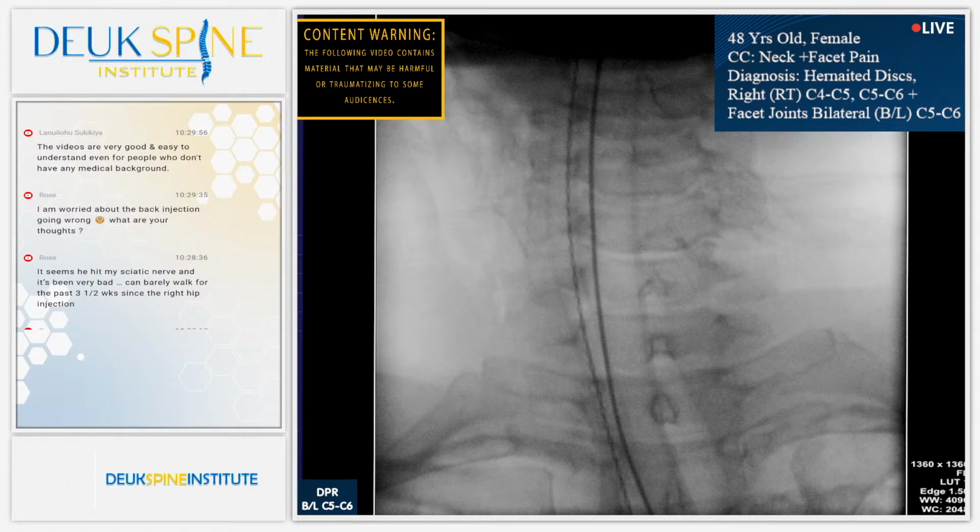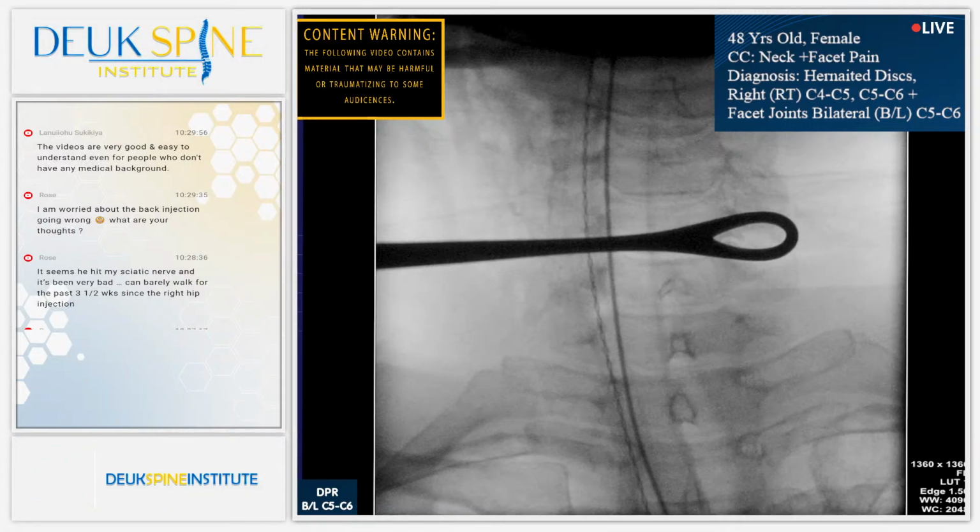I just want to show you guys the arthritis. Jordan, show them how much arthritis there is in these facet joints. That was the left side, but look at the right side. There's more. All that dark stuff, it's not normal. It's bone spurs and arthritis over there. You've got a thickening of the joints, a thickening of the bone around the joints.